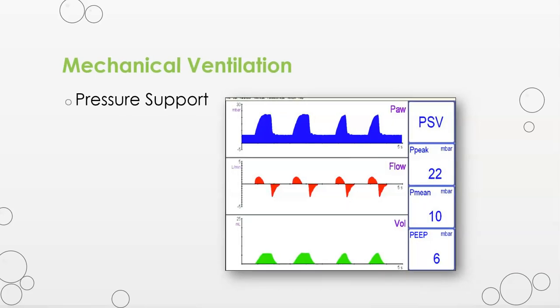The last mode I want to talk about is pressure support. These patients are ready to be extubated, as they are supporting their own respiratory rates and tidal volume. But the machine is still keeping the alveoli open to support gas exchange. In this mode, the patient cannot be heavily sedated.